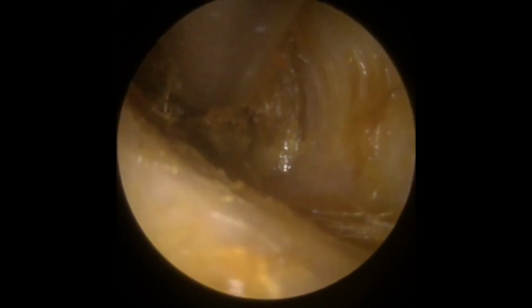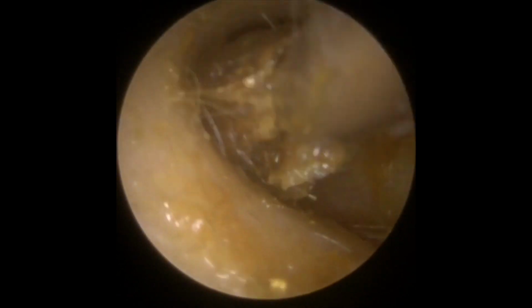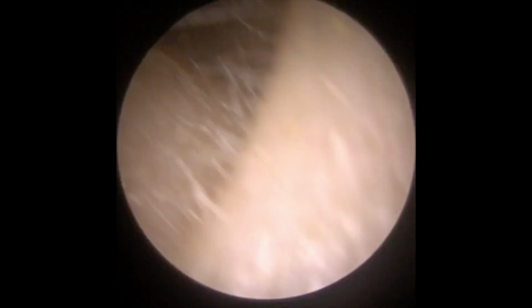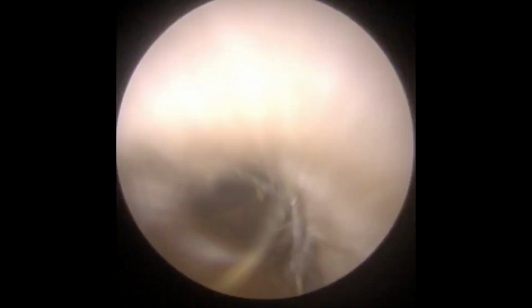There you go, you can see it just starting to lift to the right side. There you go. Just give it a bit of a wiggle, and out he comes. Just check behind that now. There we are, you can see some oil on that eardrum as well. But all nice and clear now for this patient.